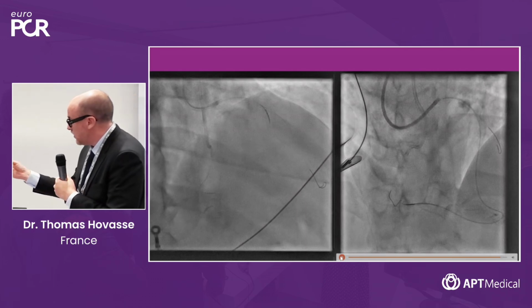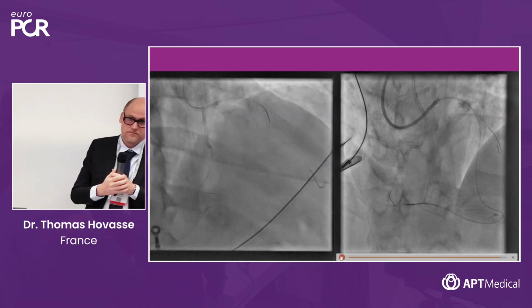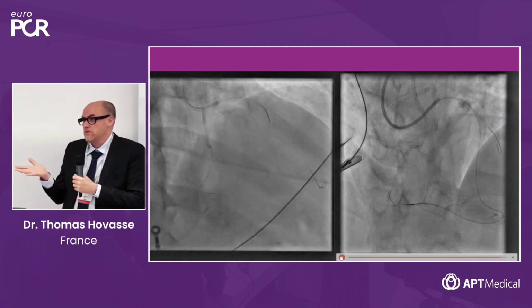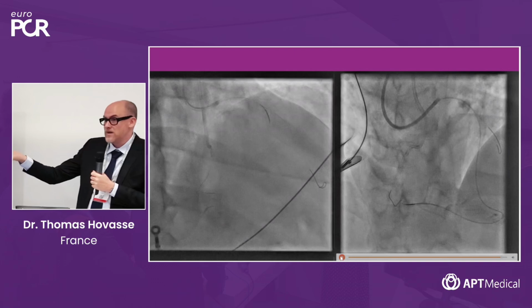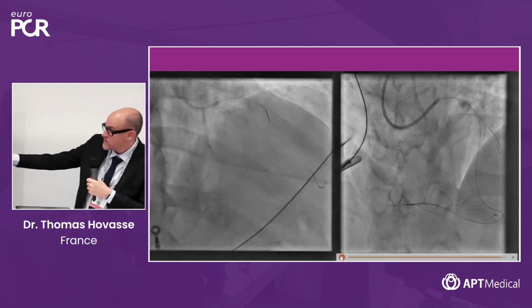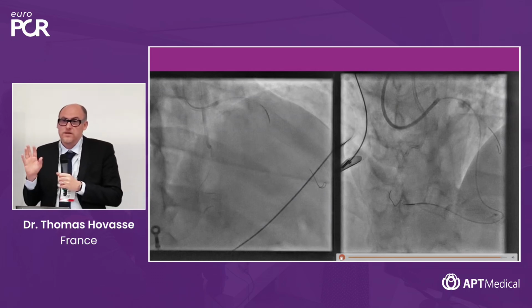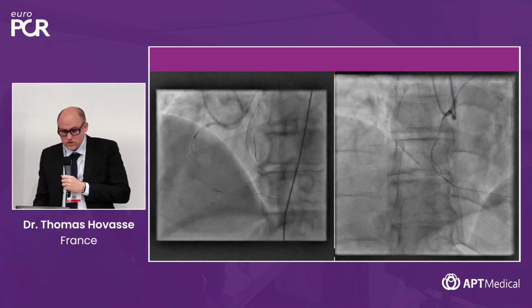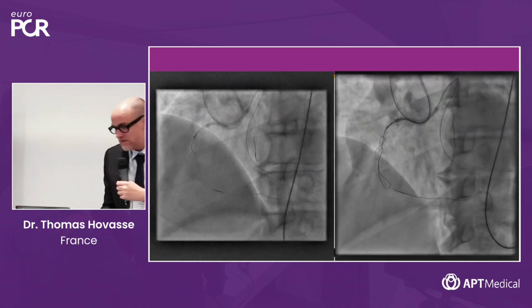I think at this point it was Fielder XT. Maybe you can knuckle over the guide. Yeah. So that's a very interesting point, and maybe you will solve many of your cases like this when the path isn't clear, when you have tortuosity, you don't know where to go. Knuckling within the CTO body, there is no risk, and you will solve the case very easily and elegantly. So you have to do a knuckle. You see the knuckle retrogradely and antegradely with the Fielder XT wire.